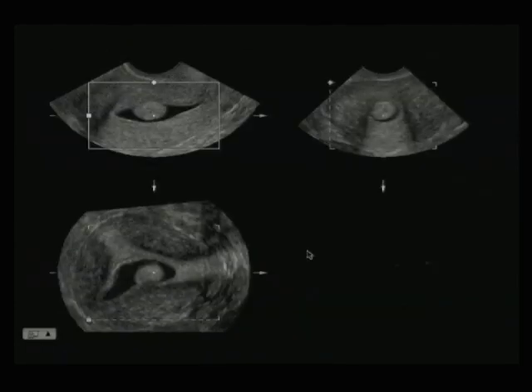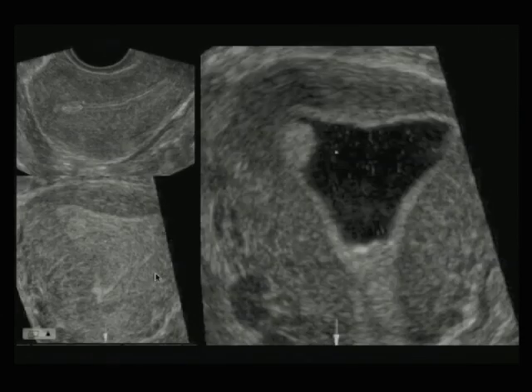Here's a patient that has just one polyp, and you can see here that I've put the dot on the polyp. And this helps me to identify the same spot on all three planes. This is the coronal plane again, and you can see that spot on all three planes. You can also see the difference between doing just a 2D, doing just a 3D, and then doing a 3D with the addition of the fluid.